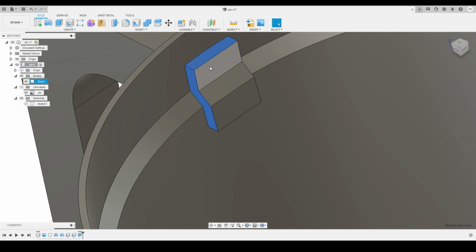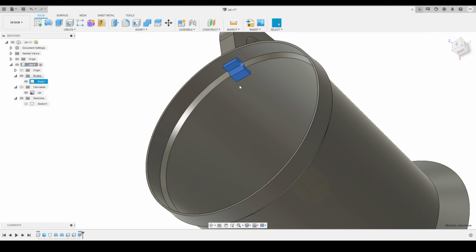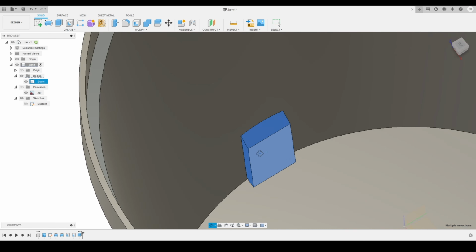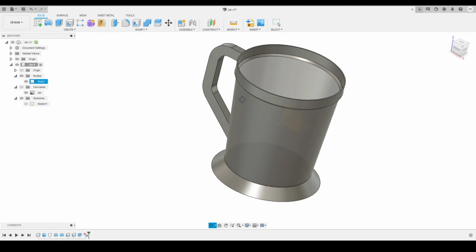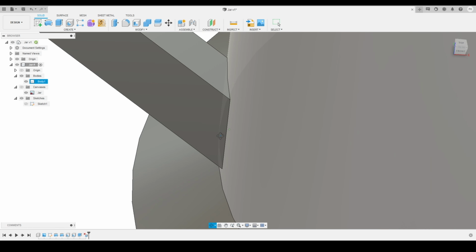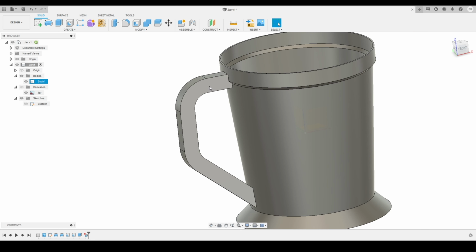So what I will do is select the faces of this extra portion inside. I will make sure that I have selected all the faces for both, like here the handle portion that is coming inside. I will select all the faces, right click, and press delete on my keyboard. Here you can see this delete. So that will remove that extra handle portion that is coming inside our jar. And now if I see my handle, here you can see it is completely perfect now.